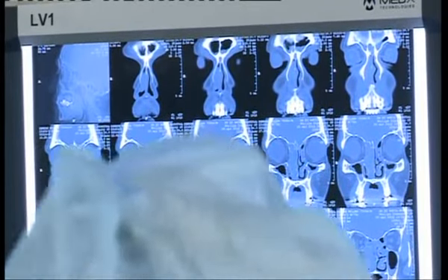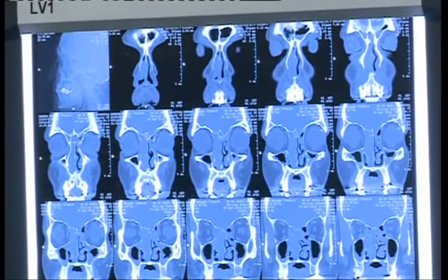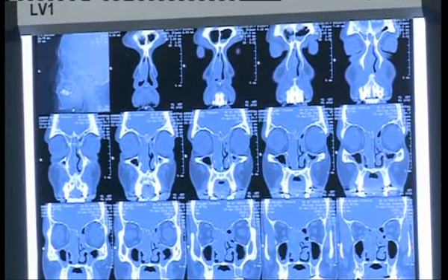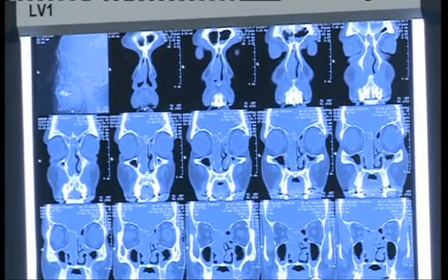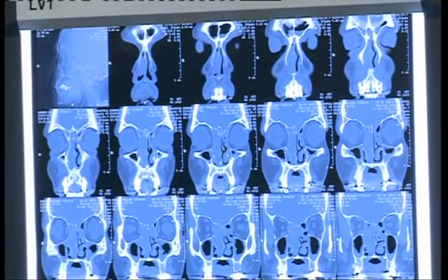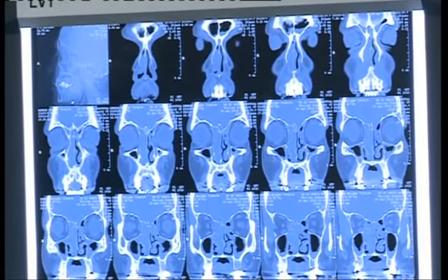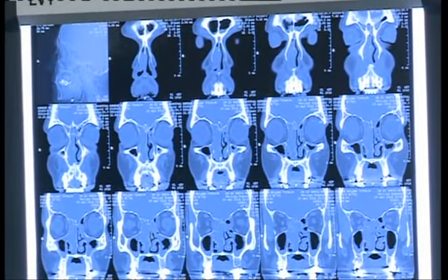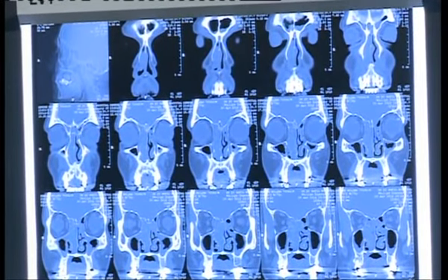Between the bone windows and the soft windows, what exactly is the difference? CT gives us the bony details, and is the best investigation for bony details. We all know soft tissue details are never given better by the CT scan. But yet, the differentiation of the soft tissues to some extent can be noted on a soft tissue window CT scan.